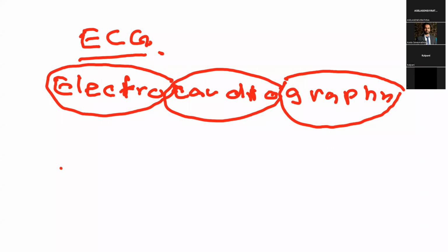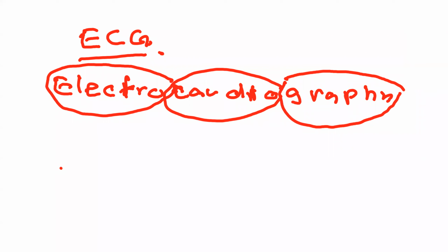We are just looking at what electrical activities are happening in the heart, and how to understand or realize those electric activities using a graph.